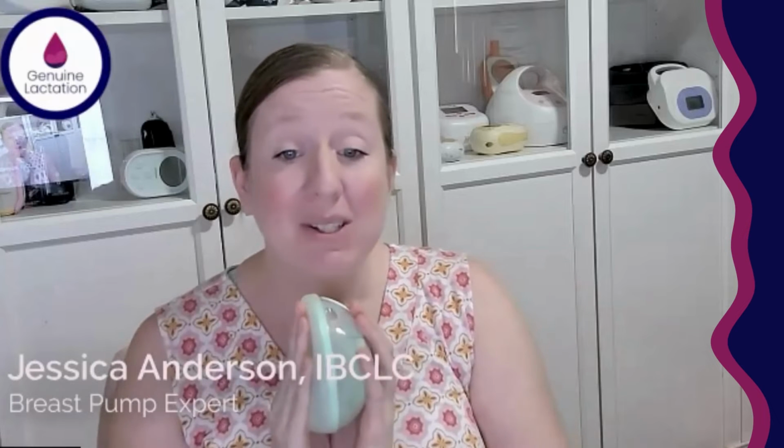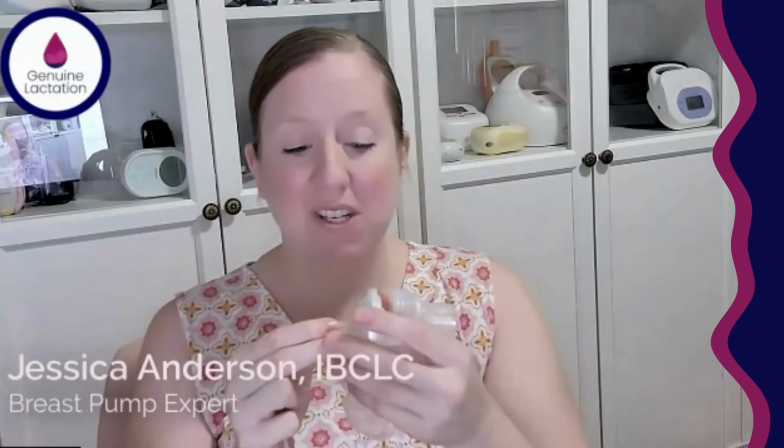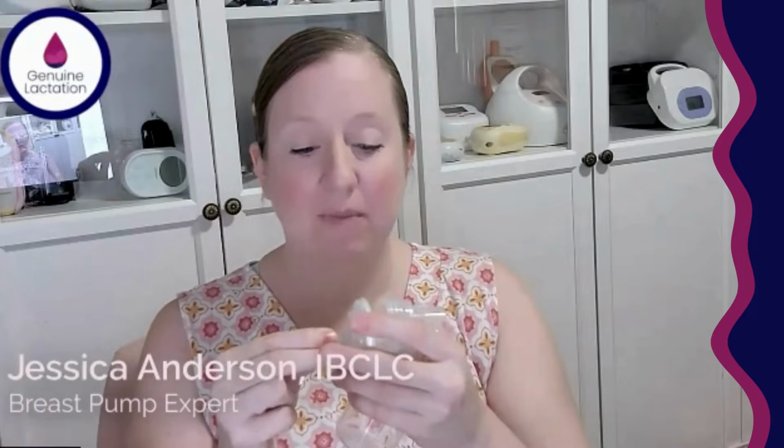These cups are also extremely versatile in that we can hook them up to a lot of different pumps and vice versa because of the fairly universal attachment of the cups. Here's that tubing that I just pulled off. You can actually hook up traditional flanges to your Elvie Stride. So this is just a Spectra style long stem backflow protector hooked up to a Medela bottle. It's just a generic setup.